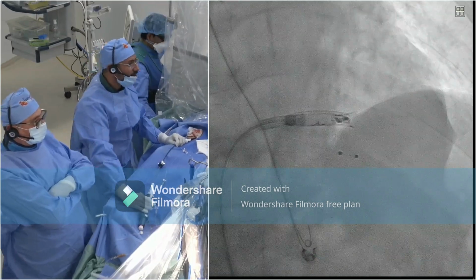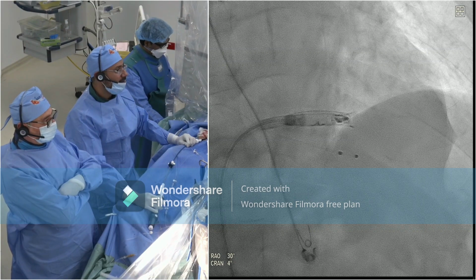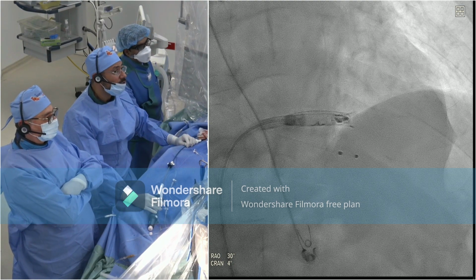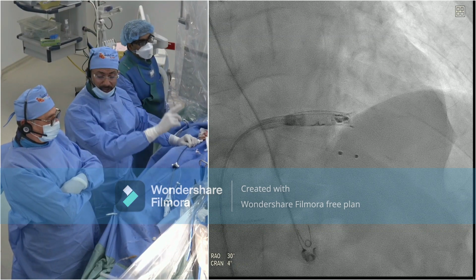And each time I look in RAO and LAO to make sure that I am facing the septum, followed by injection of contrast to make sure that I am facing the septum and away from the apex, in order to avoid the question that was asked by Dr. Hikmat, which is perforation. Can we have LAO, please?